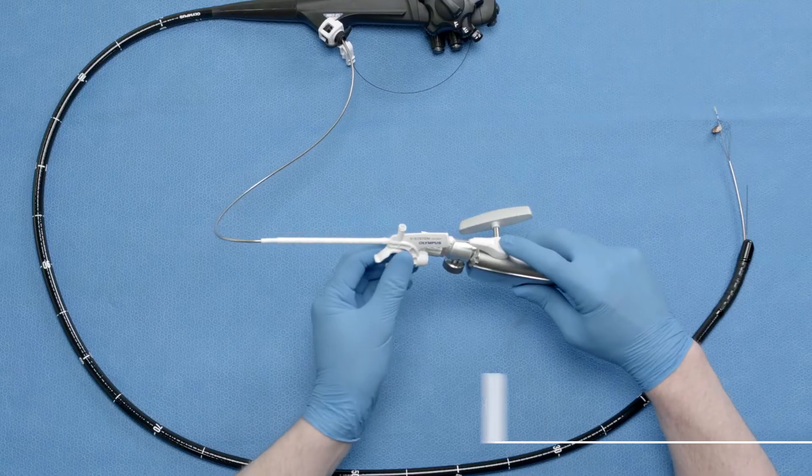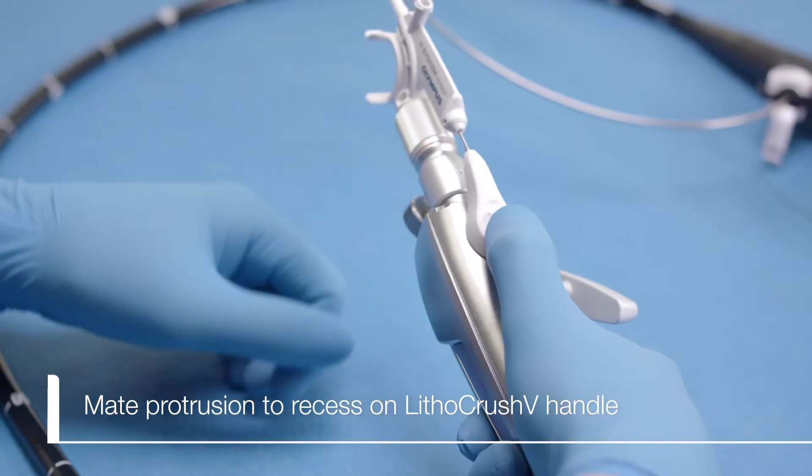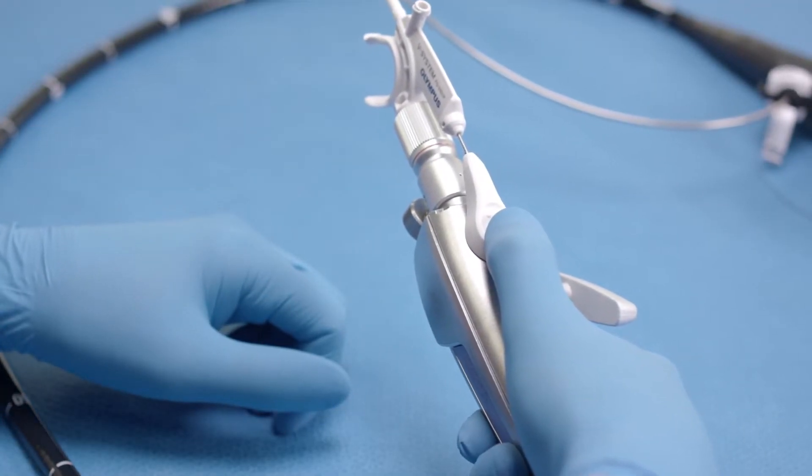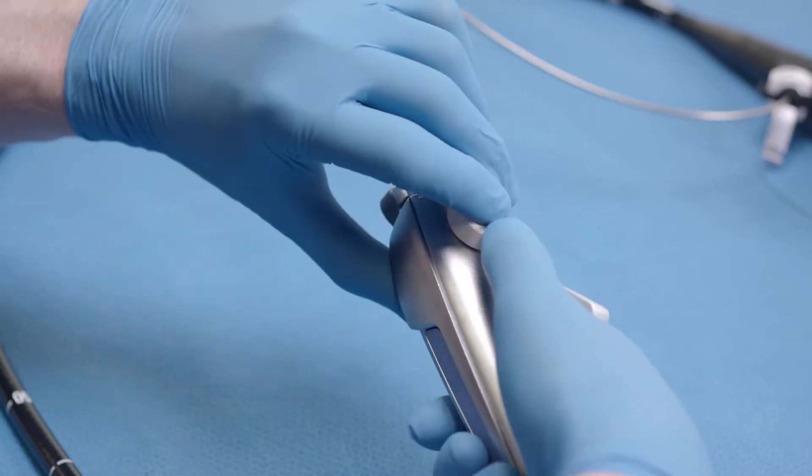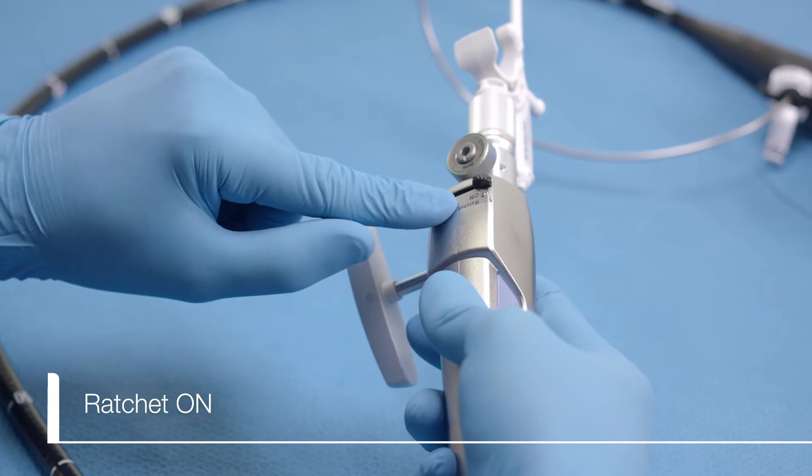Next, insert the protrusion on the VortiCatch V Handle into the recess on the control rod on the Lithocrush V Handle. Push the ratchet switch on the Lithocrush V Handle into the on position.